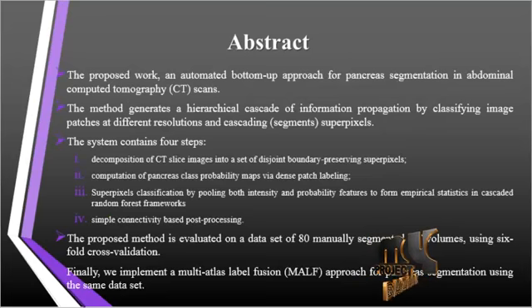Now we discuss the abstract for the process. The proposed work is an automated bottom-up approach for pancreas segmentation in abdominal computed tomography, that is, CT scans. The method generates a hierarchical cascade of information propagation by classifying image patches of different resolutions and cascading segmented superpixels.